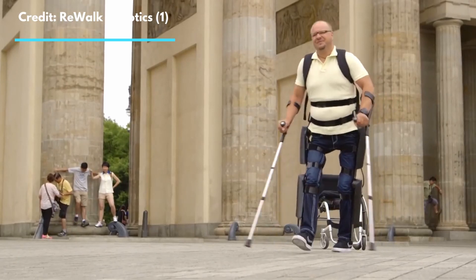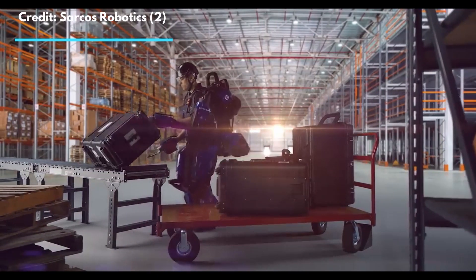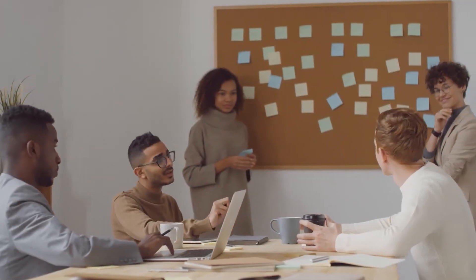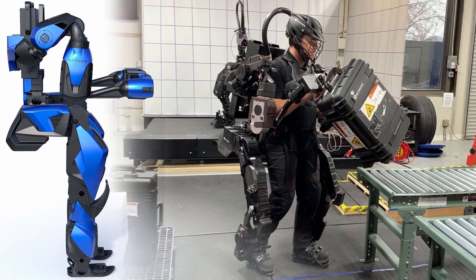Exoskeletons are amazing machines that can help us overcome disabilities and even augment our strength. But how do you control one? How do you go from intention to movement? A simple question that leads to a rabbit hole of many ingenious ideas. Why is this question important? It's ultimately about practicality and safety.